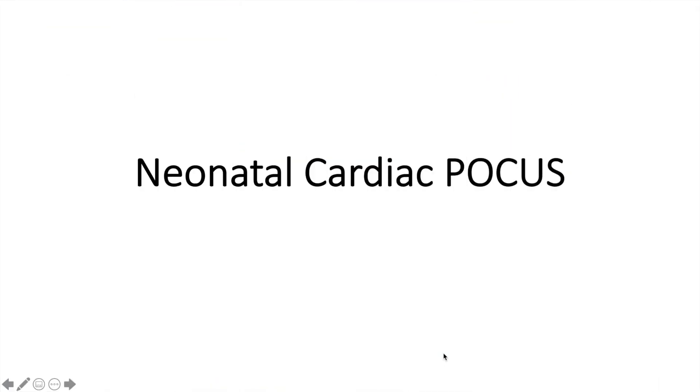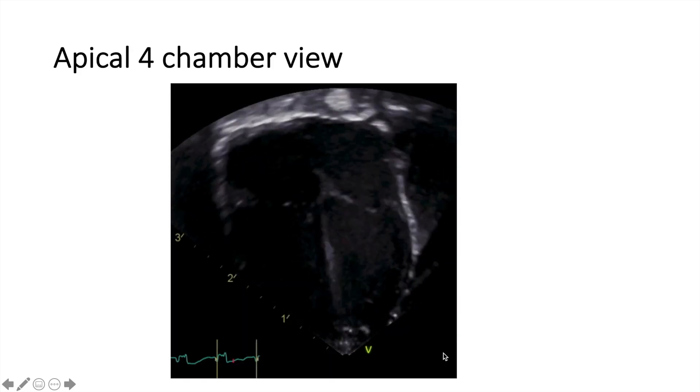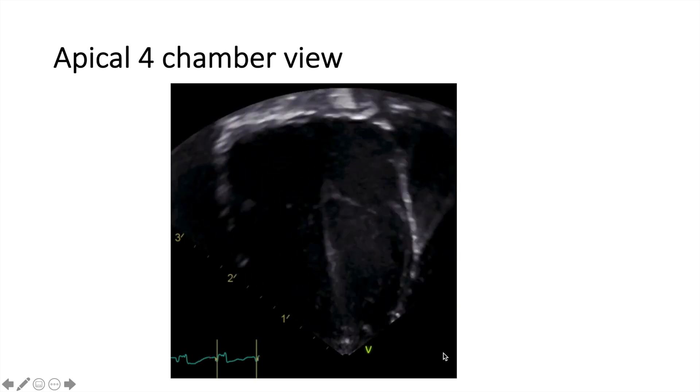We're going to go over the neonatal cardiac POCUS. To do so, we have to look at different views of the heart. The first one is called the apical four-chamber view. This is it — this is the apical four-chamber view.